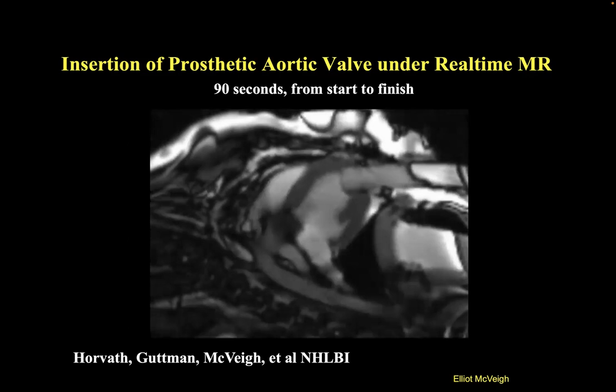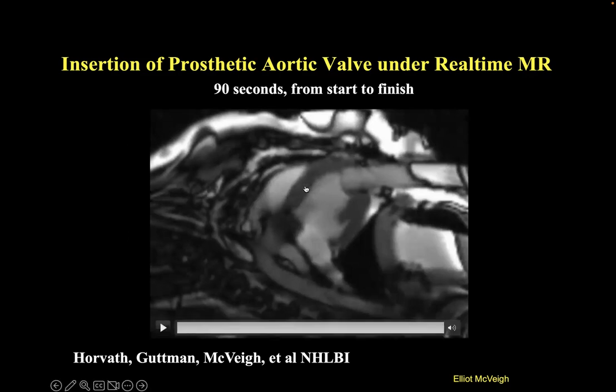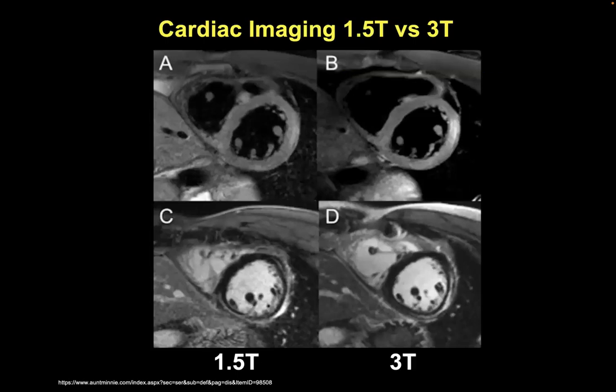We got a special set of headphones and mics built so all the physicians could talk to each other during the intervention. And just as before, everything has to be non-ferromagnetic, so you need to design a whole bunch of new stuff. But this was pretty cool. I love this project.